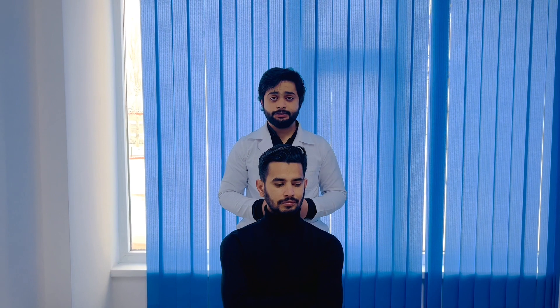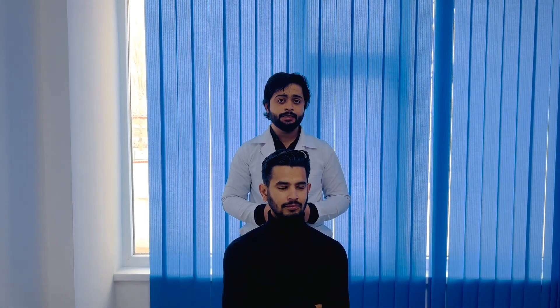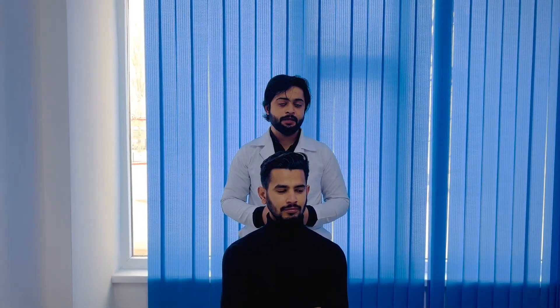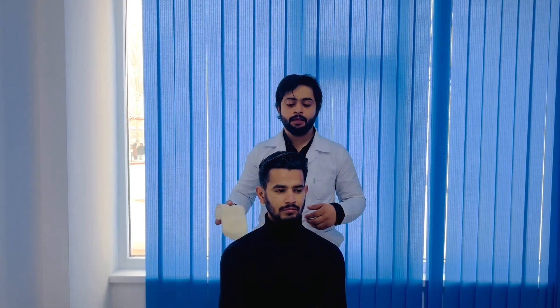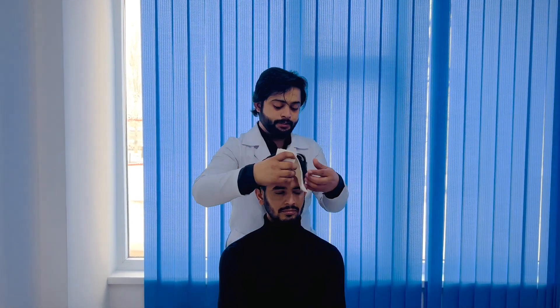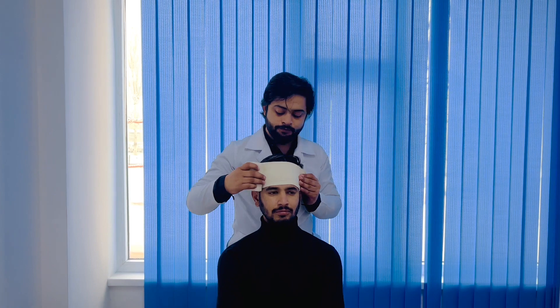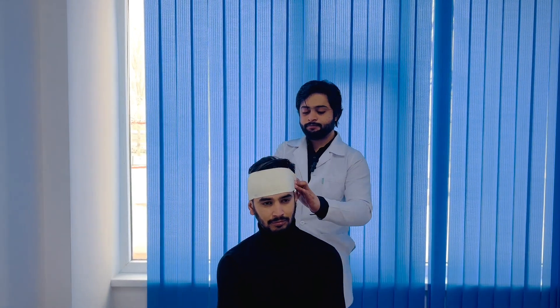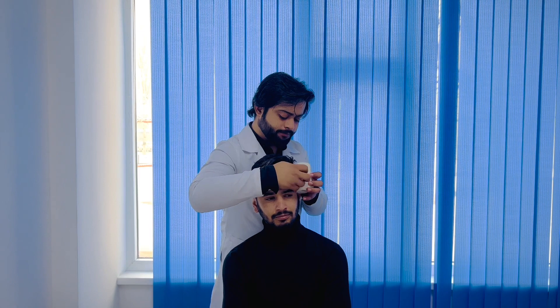Welcome back to Dr. Najib's lectures. In this video we will talk about the monoocular bandage, or bandage towards one eye. So let's start. First of all, you will make two circulations around the head.